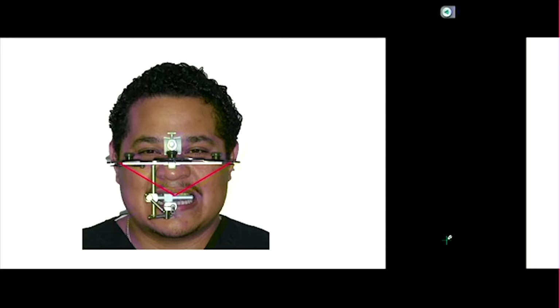When you use a face bow, you'll have recorded that information in this face bow record, and then when you put it on the articulator, you would anticipate that the maxillary cast is also 5 millimeters from the center of the articulator. So whatever is reflected in the patient's mouth from the frontal plane in terms of a lateral direction, you have captured that information as well. Similarly, if everything's dead center, then you anticipate that the cast would be dead center as well.